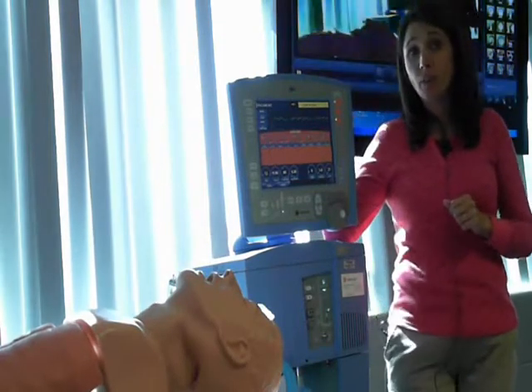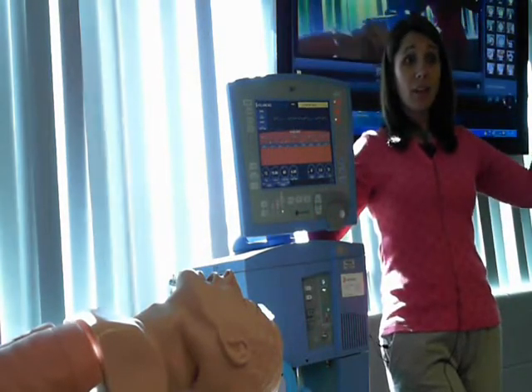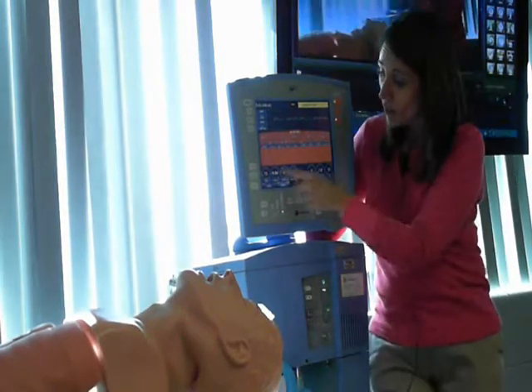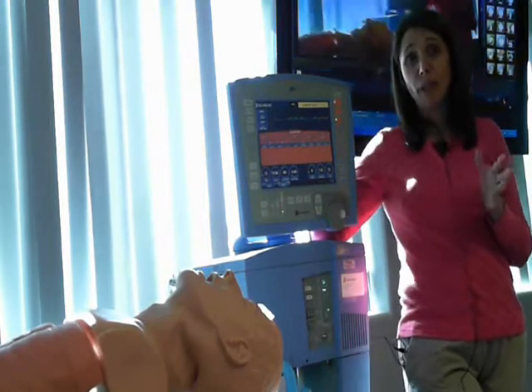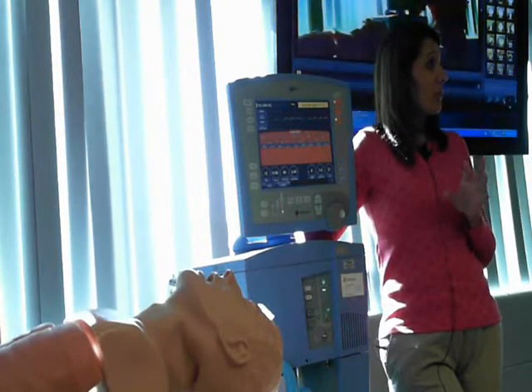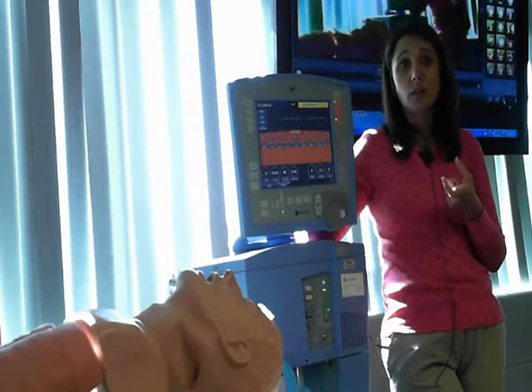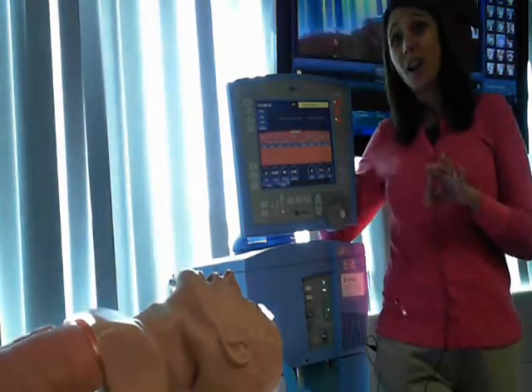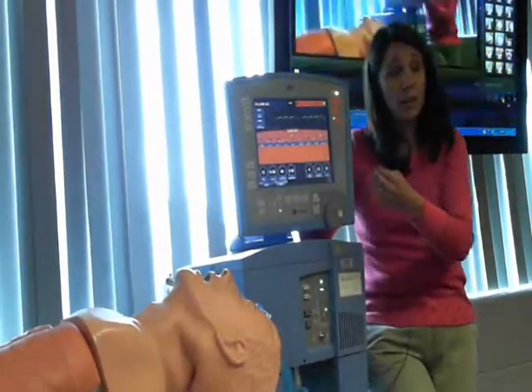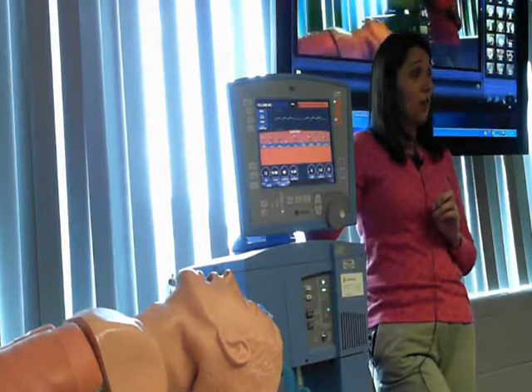You have to remember that, because if you are caring for a patient who is overweight or obese, it would be a mistake to up the tidal volume because their lungs don't grow as we gain weight. Okay, so tidal volumes commonly for most adult males and females will run anywhere in the 500 to 750, sometimes 800 range. That's a very common range for most average adults who do not have any significant lung disease. Okay, this number is going to vary depending on what form of lung disease your patient has.